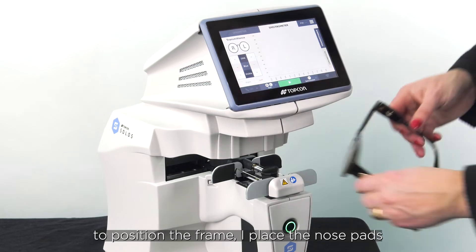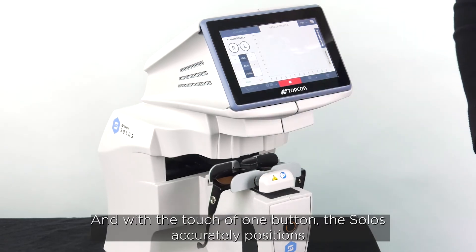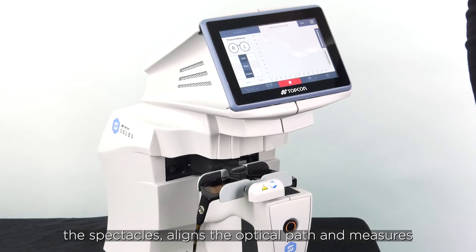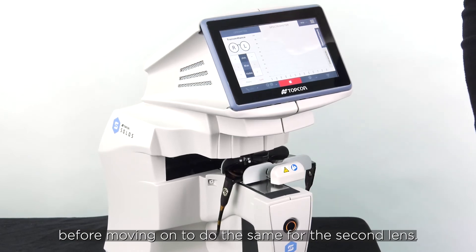To position the frame I place the nose pads against the nose piece, push away and release, and with the touch of one button the Solos accurately positions the spectacles, aligns the optical path and measures the transmittance and chromaticity of the lens before moving on to do the same for the second lens.